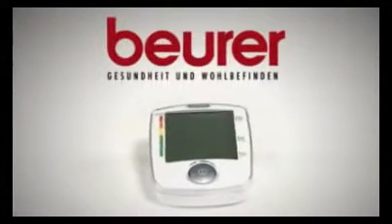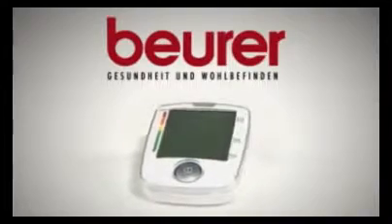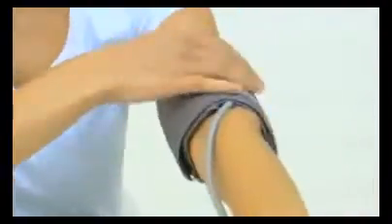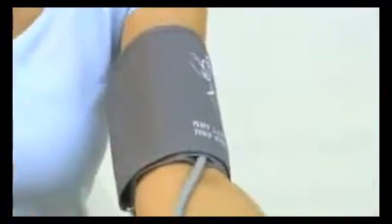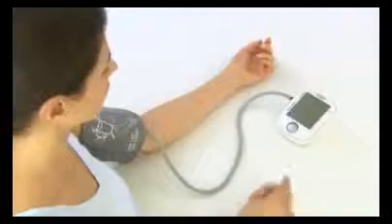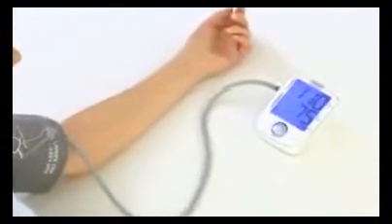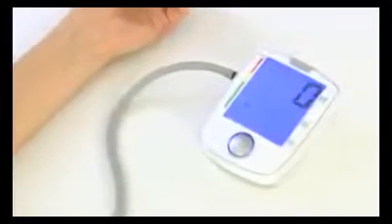Easy to use, measure your blood pressure at home, simply and safely, with the Beurer BM44 Upper Arm Blood Pressure Monitor. The BM44 excels through its easy operation. With just one button, the blood pressure monitor is ideal for taking blood pressure measurements at home.